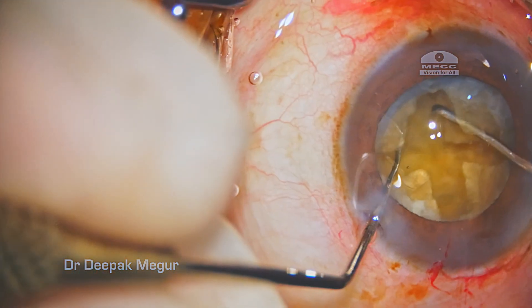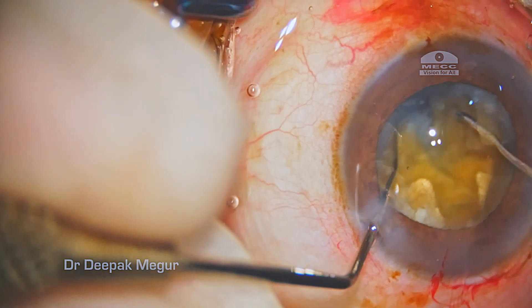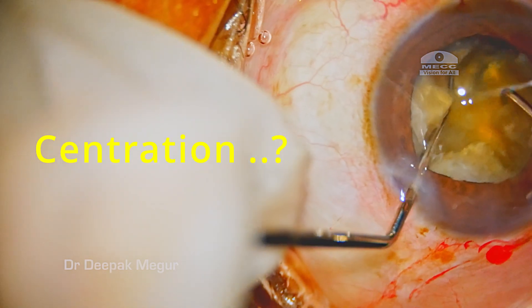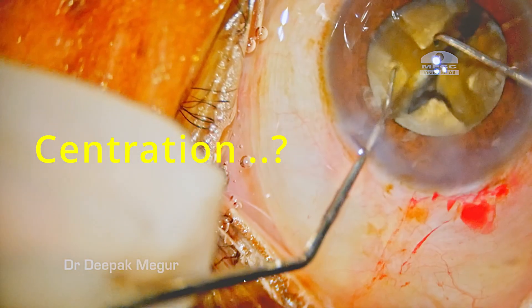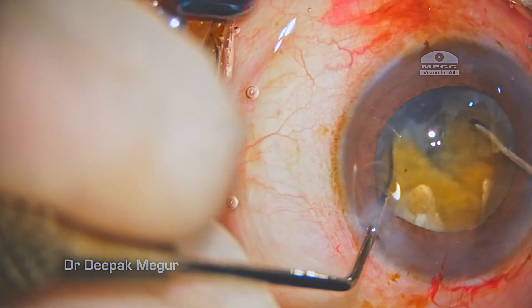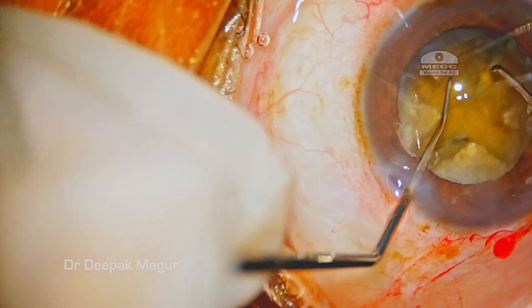Moving on to the lateral separation aspect, all the fragments are separated from each other quite successfully, although it appears less well controlled. A few reasons for that: the site of action is happening in the peripheral field of vision of the surgeon rather than being in the center, and secondly the two instruments are not placed deep enough in the trench so that the separation can be less stressful.